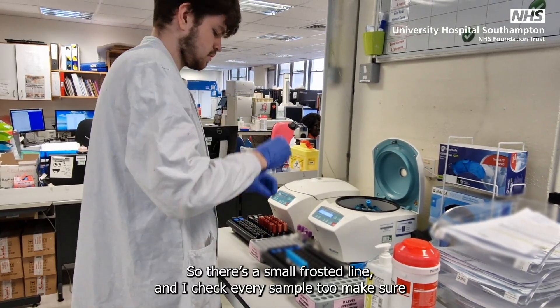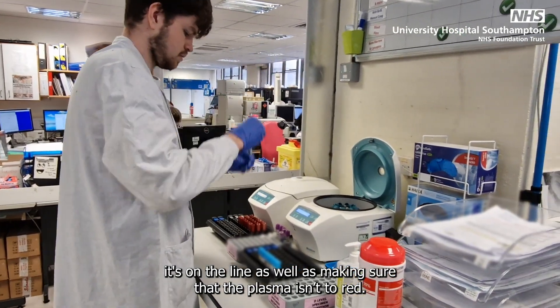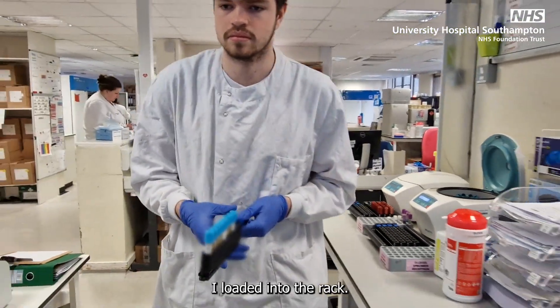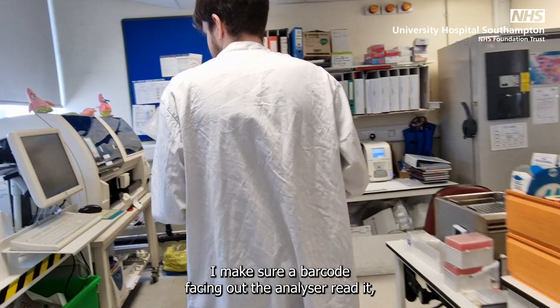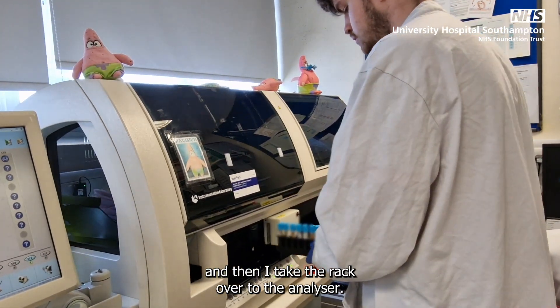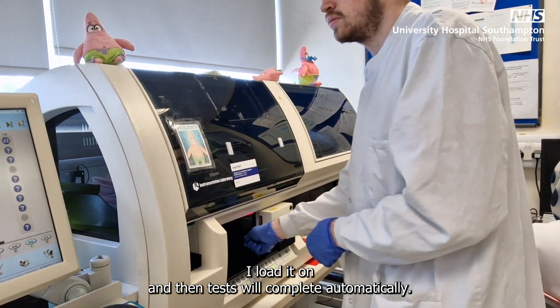There's a small frosted line, and I check every sample to make sure it's on the line, as well as making sure the plasma isn't too red. I load it into the rack, making sure the barcode's facing out so the analyzer can read it, and then I take the rack over to the analyzer, load it on, and then the tests complete.